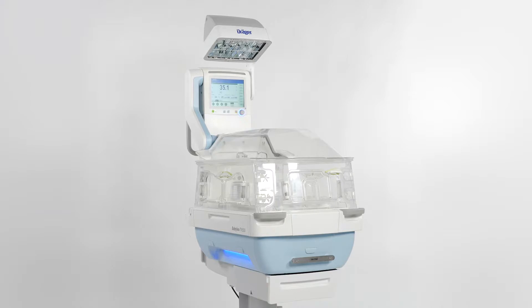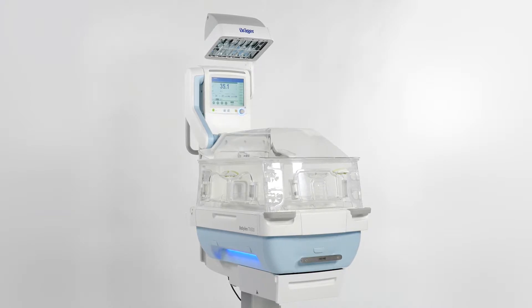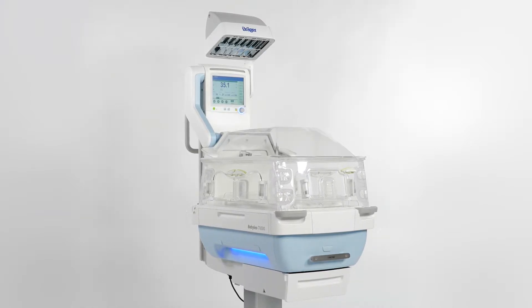Note that this adjustment can be performed at any time. It is recommended to do the oxygen sensor adjustment before the next patient is admitted to Baby Leo. This way you will avoid the adjustment alarm when the baby is in Baby Leo. The dialog will then show you the next adjustment date for the oxygen sensor.